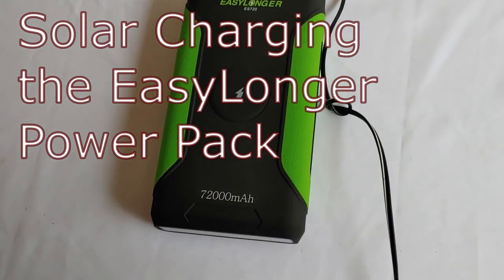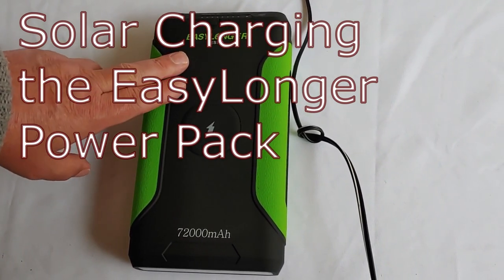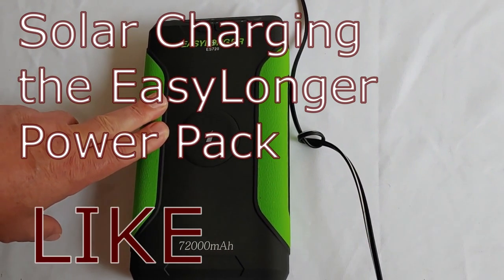Hello all, Shoestring here. Another short video where I'm answering a question I have received on our site. It was about the Easy Longer ES720. The question is: will you show us how to charge this with a solar panel?